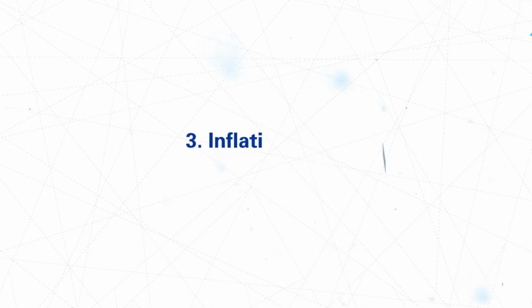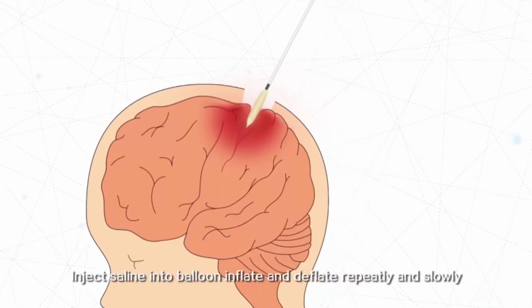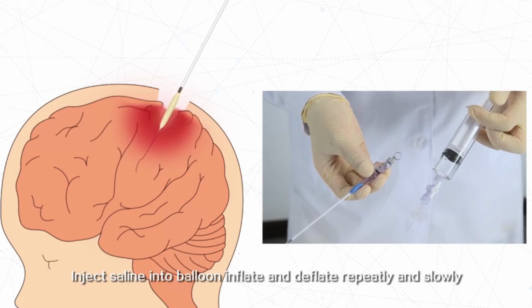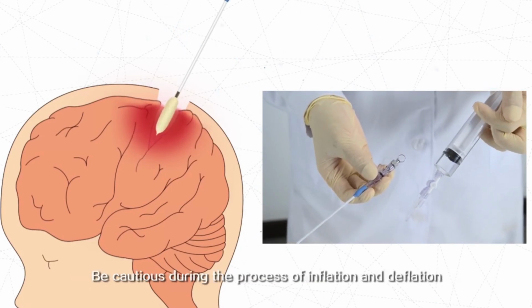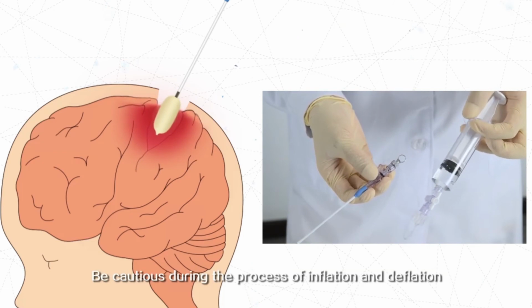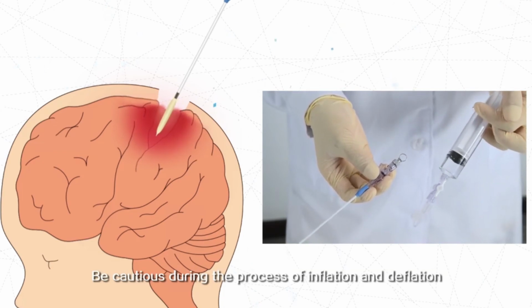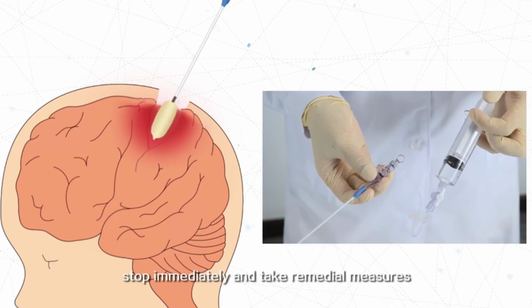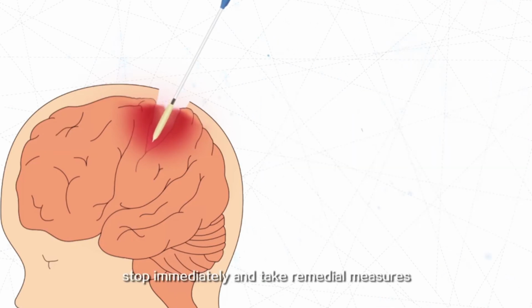3. Inflating balloon. Inject saline into the balloon. Inflate and deflate repeatedly and slowly. Be cautious during the process of inflation and deflation. If an abnormal incident occurs, stop immediately and take remedial measures.